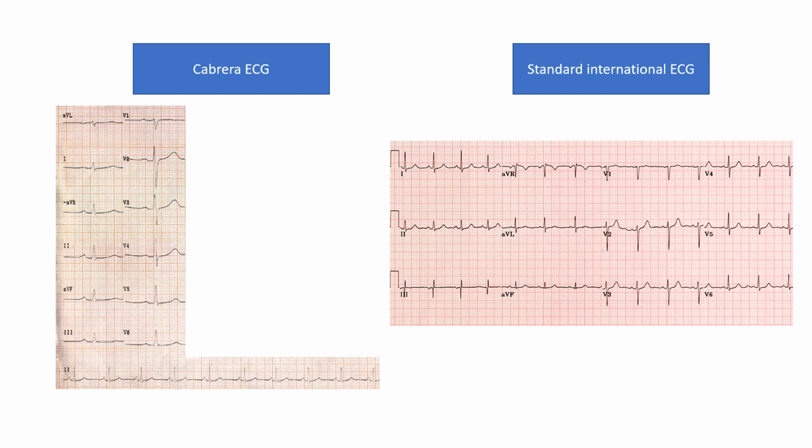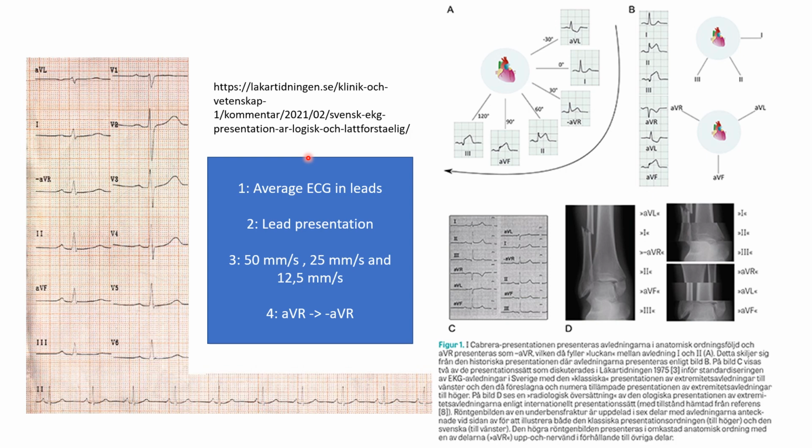But let's see, why is the Cabrera ECG so important? I think we can learn a lot about interpretation of the ECG by knowing just a little bit about the Cabrera ECG. If you want to learn more about this, there's a Läkartidningen article about this. I think it's also in English even. And there are four major changes that you should know as a newcomer to the Cabrera ECG.